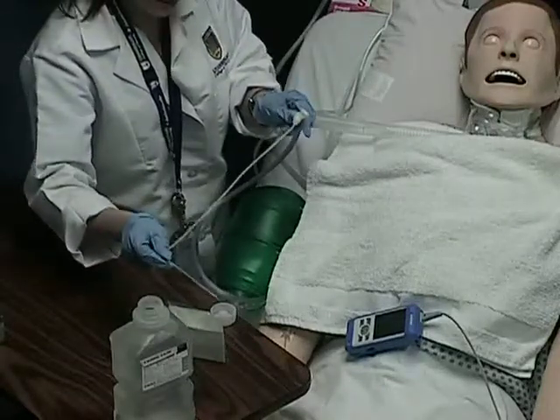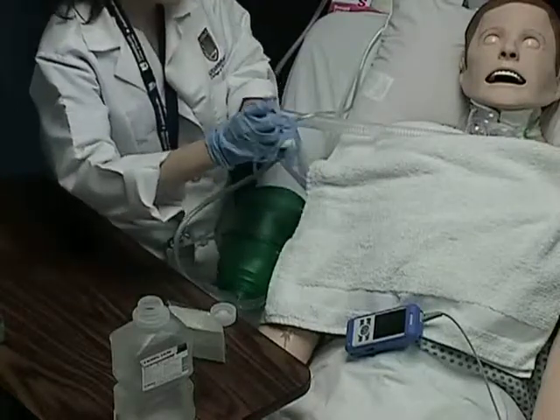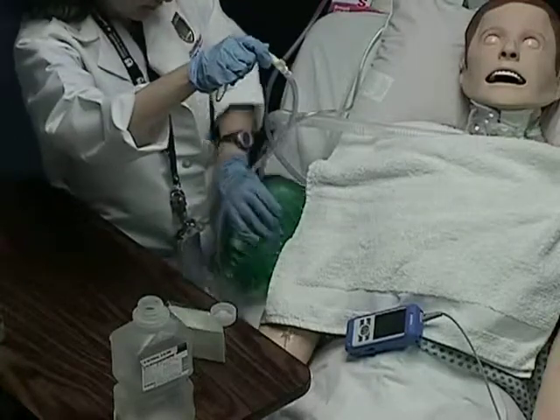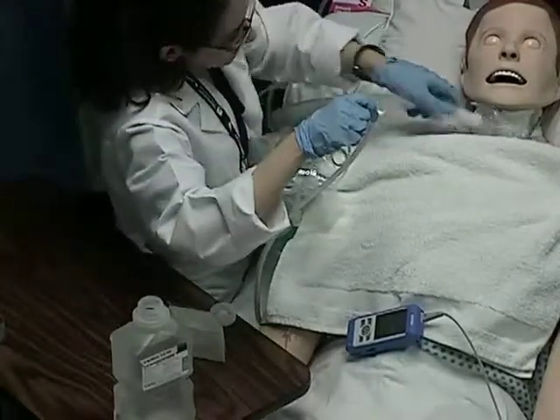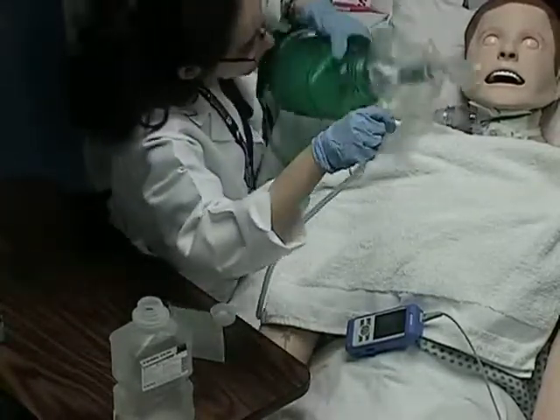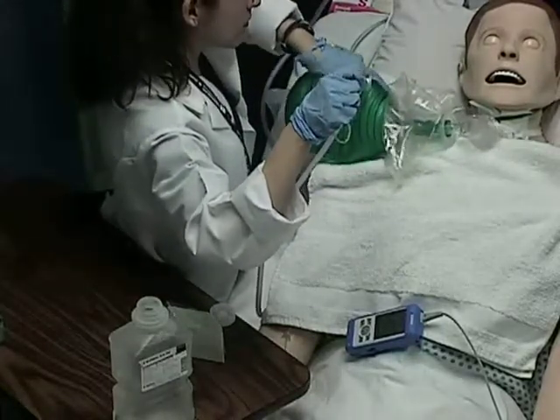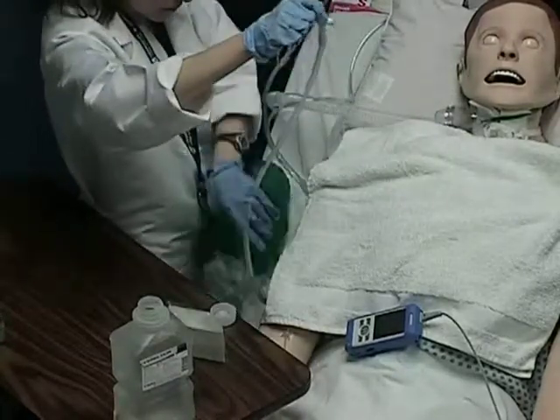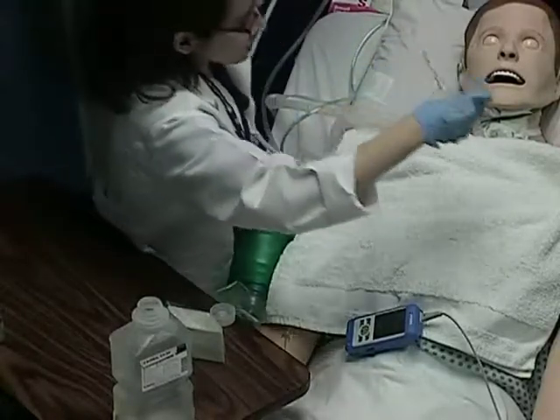You will now check the patient's SpO2. Hyperinflate or hyperoxygenate patient before suctioning. After doing so, you will insert the catheter appropriately until resistance is met.